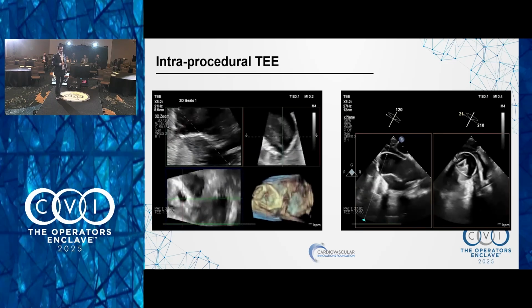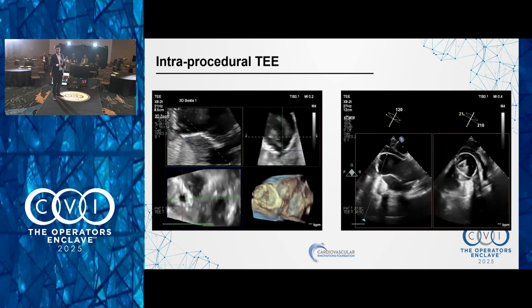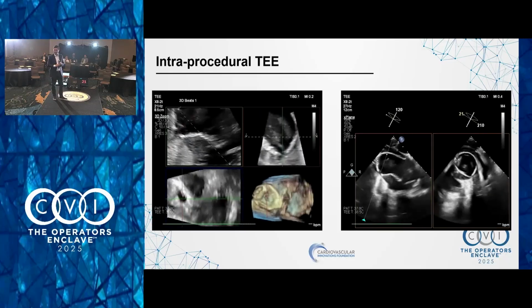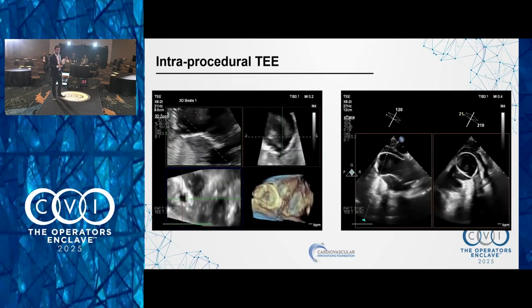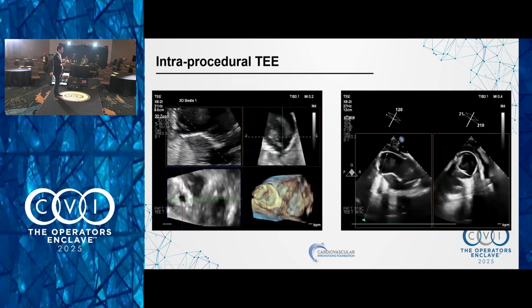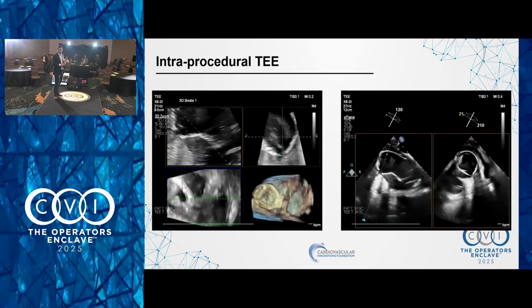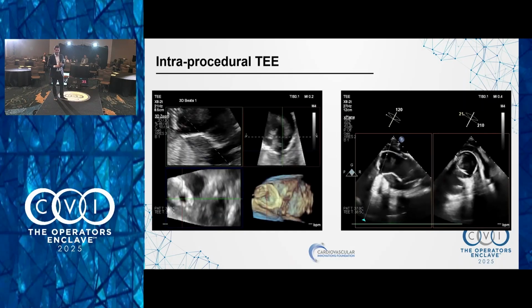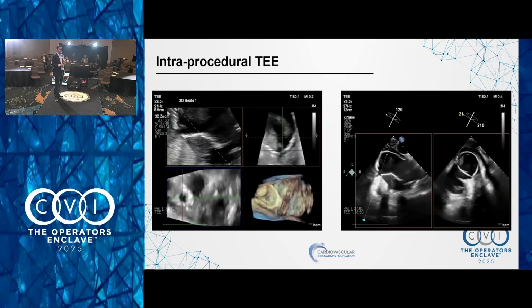Sounds like Kashish should do it the other way, huh? Put a plug in first, because otherwise I'll have to go through the stent struts, and I'll have to leave one of the discs in the coronary artery to prevent having issues. But people have done it if it was a small pseudo: put a stent in, and then just coil through it. Then it's fine. But this is not coilable. And the stent would need to be out in the aorta a little bit for sure.